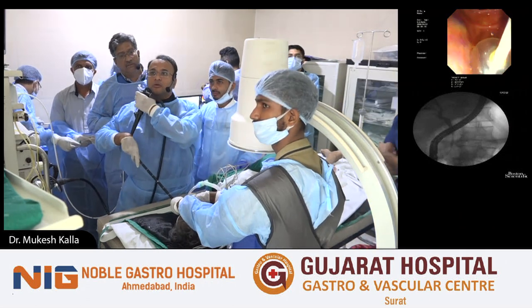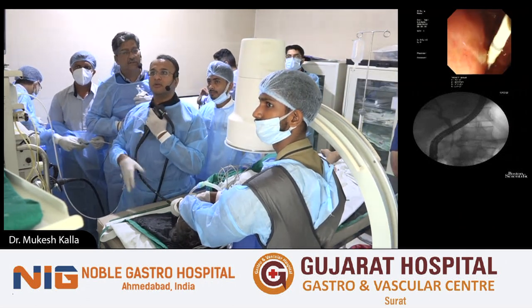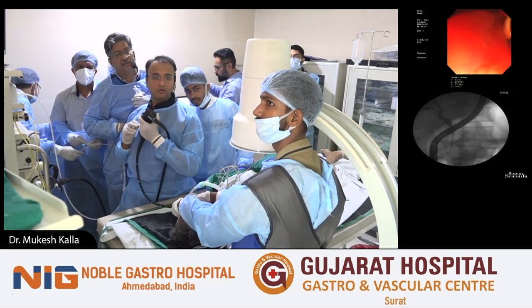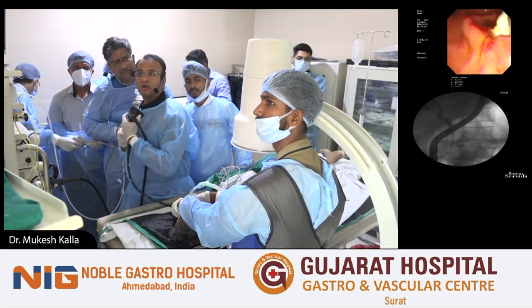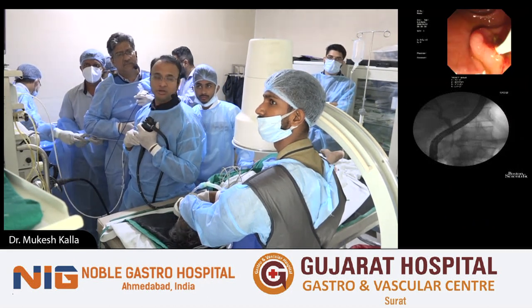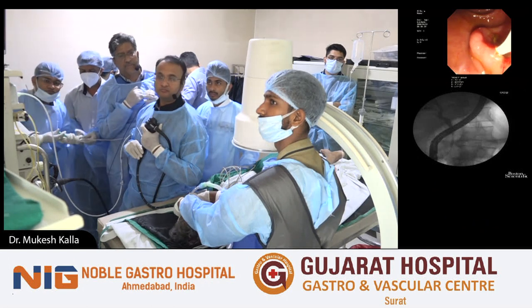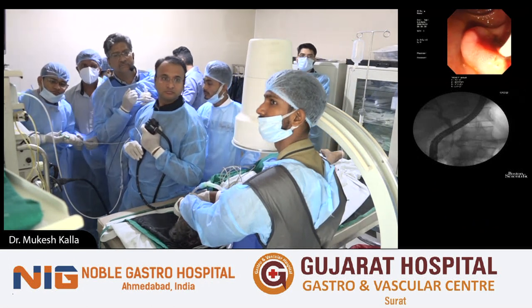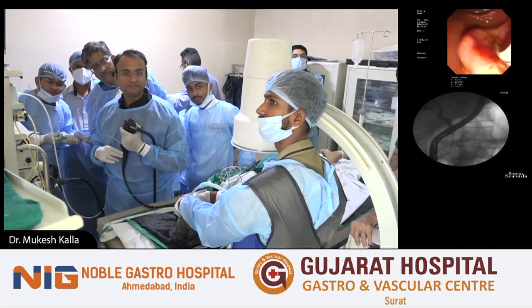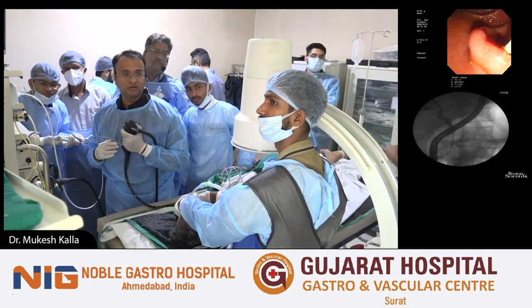Because endoscopy is, I wouldn't say cheaper. Of course, it is cheaper, because now even laparoscopy is not cheap. It's quite expensive. So compared to that, in spite of the instrument cost being higher than the surgical instruments, endoscopy is still cheaper for this large CBD stone. So I would just give a chance to endoscopy. Most of the time that will solve the problem.